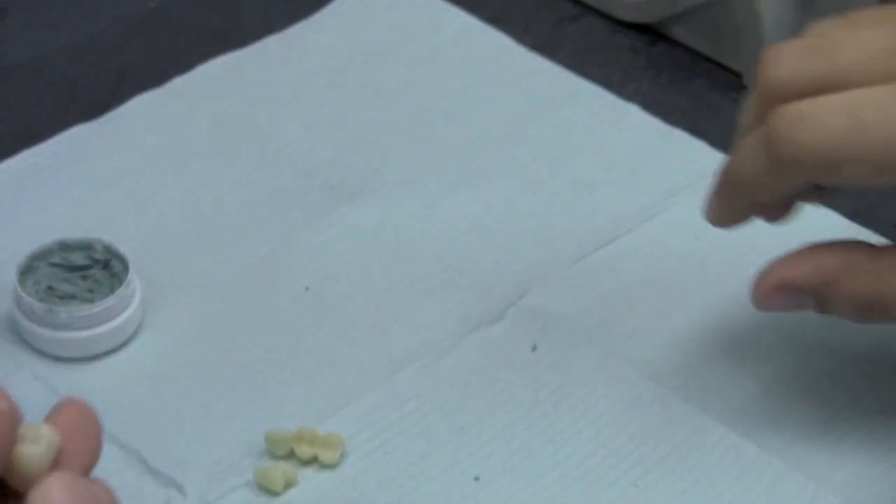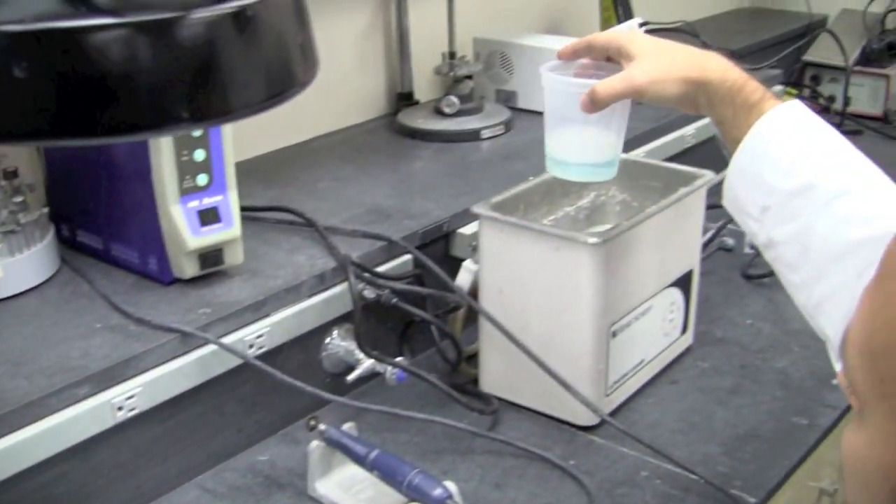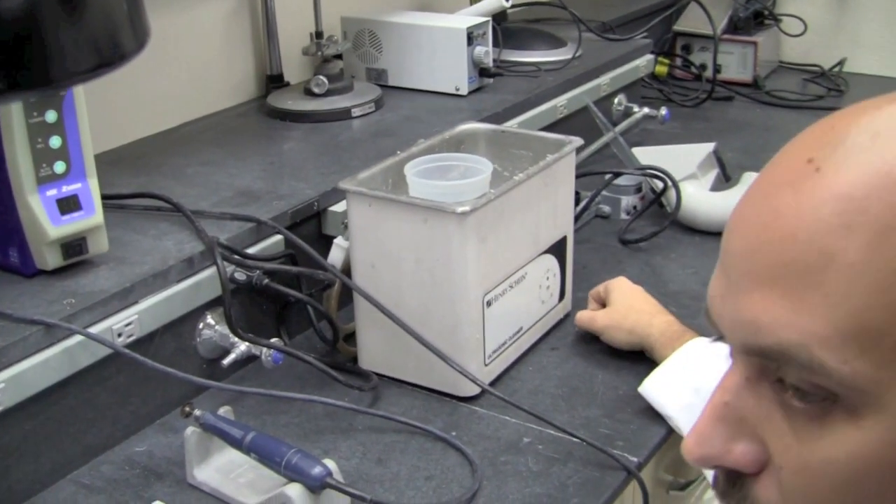Once you're finished, you'll take it and drop it in your vat of Dawn dish soap and water and put it in your ultrasonic. I typically run it for about five minutes.